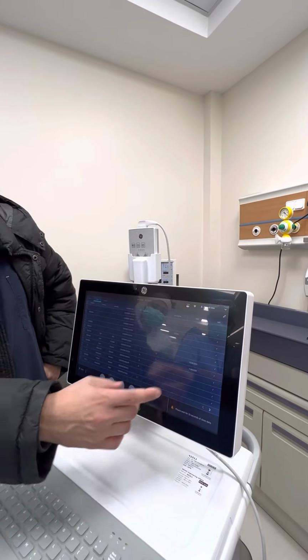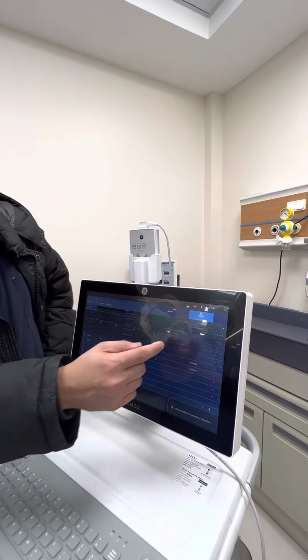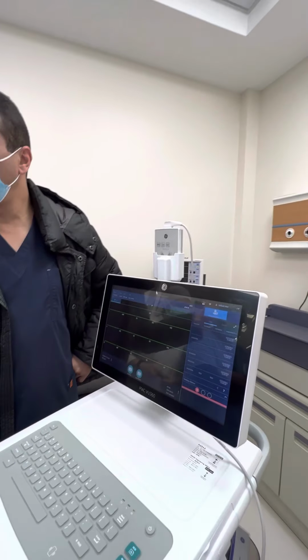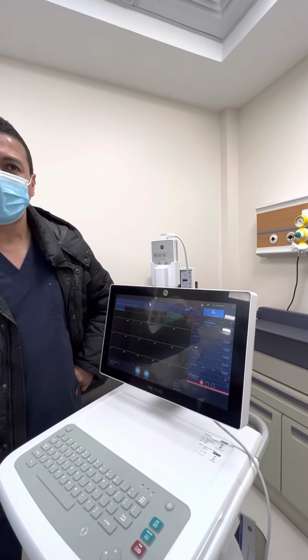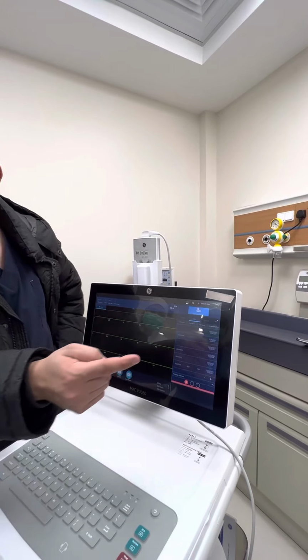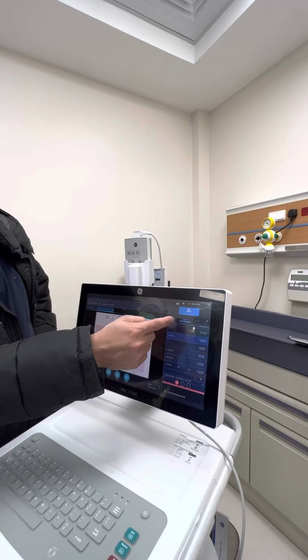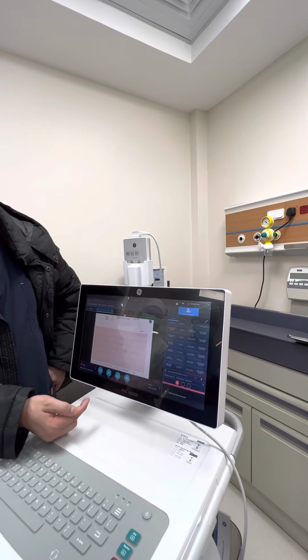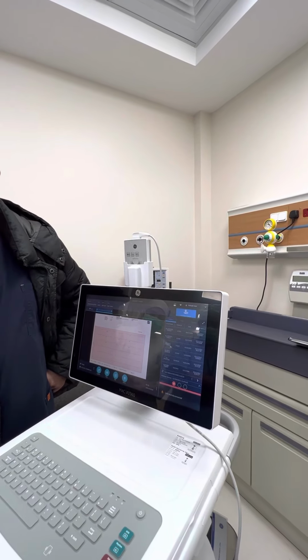The report is here, right? So we did acquire the ECG. The report is under the files. So you will open a file, place the order, then reach your report, go to your order, check your order in here, then attach it to your report, then do transmit. Okay.